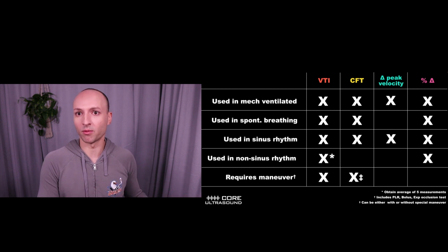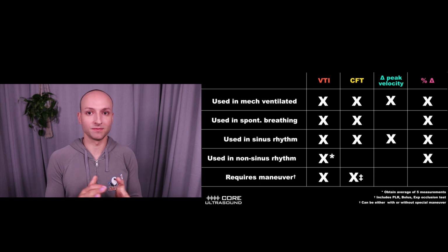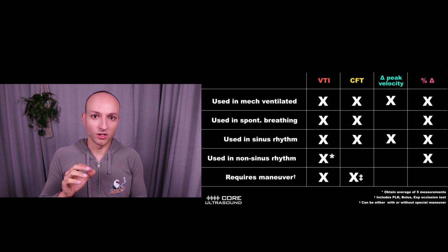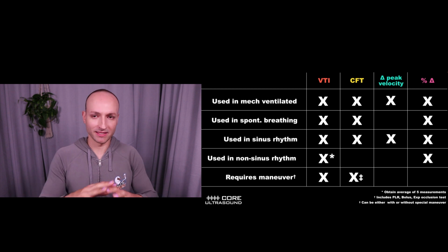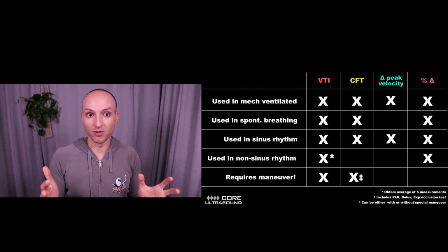And the reason why, by the way, is because if you have somebody with an arrhythmia, they're obviously not going to have a consistent kind of flow going to wherever you're looking, carotid, jugular, the heart. And so that's why you have to average it, right? Because they assume you take the average of 5. That's probably the right answer somewhere there.